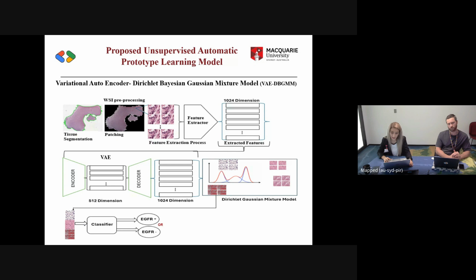It takes advantage of the Dirichlet process, which models the distributions of features, and it learns the optimal number of clusters from a mixture of many, or maybe I can say an infinite number of clusters. This is a Bayesian Gaussian mixture model, which doesn't rely on a predefined number of clusters. This mixture will give us the best and optimal clusters.